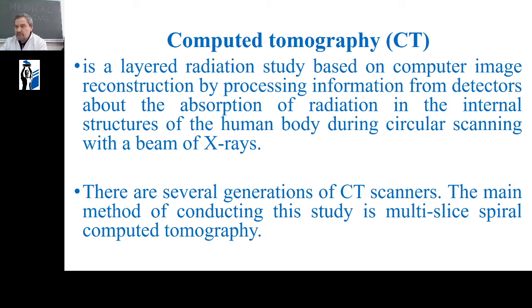Information from them is read immediately after absorption of radiation, and scanning takes place in a circular manner. There are several generations of CT scanners. The main method of conducting this study is multi-slice spiral computed tomography.